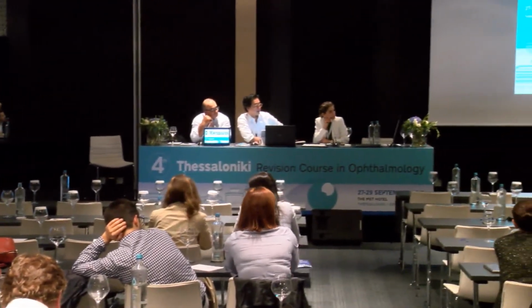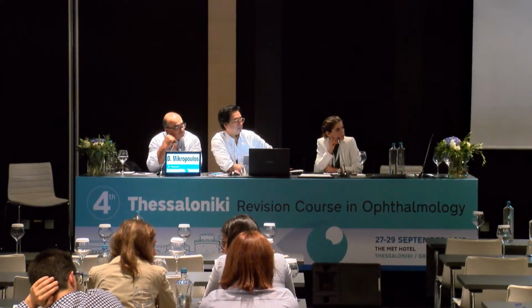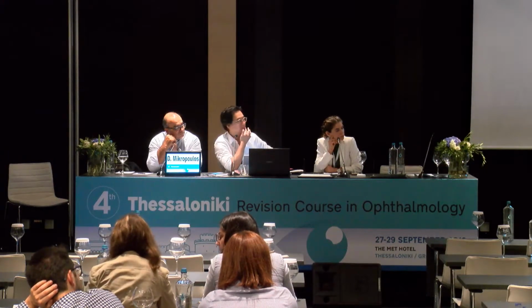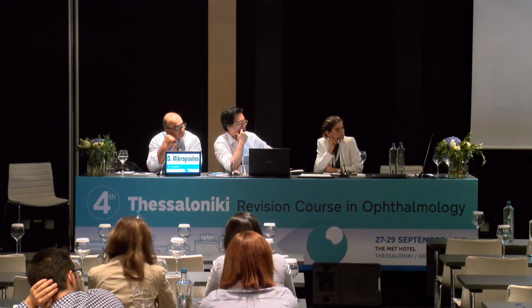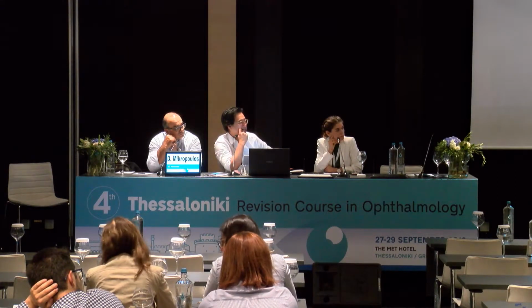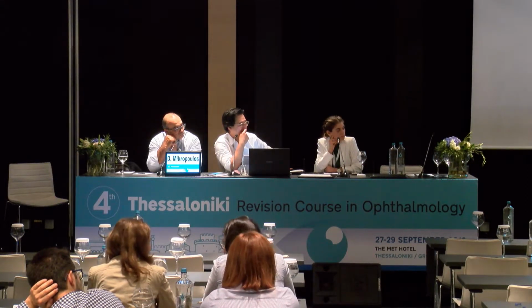Again, for funny-looking, glaucomatous-looking discs, all there is to it is just large optic discs, which are very obvious, both in your examination when you measure it with your lens, but also in OCT. You see 2.5 discs. They look really cupped, and opticians get worried, and everybody may have a borderline pressure, and everybody wants to treat them. That's another pitfall on imaging that we'd like to highlight.